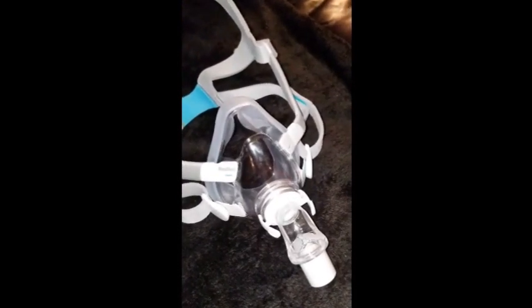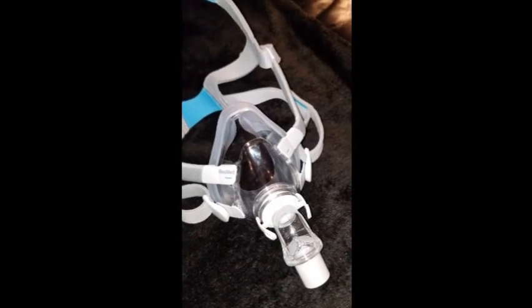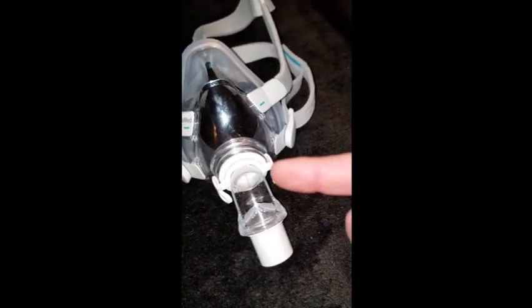This is the F20 in the flesh. Notice that it's a nice solid mask — there are no exhalation ports on the mask itself. You have a nice silicone-type seal. All the magic happens right here at this elbow.